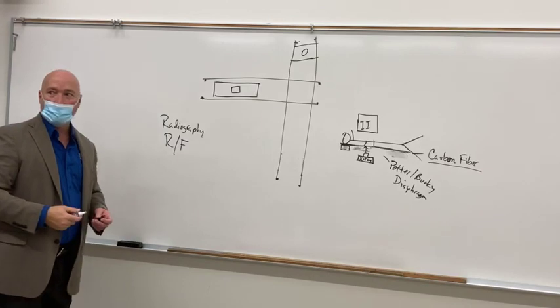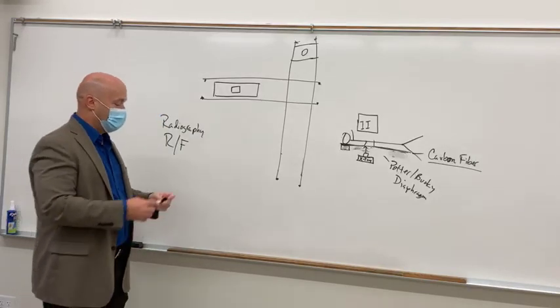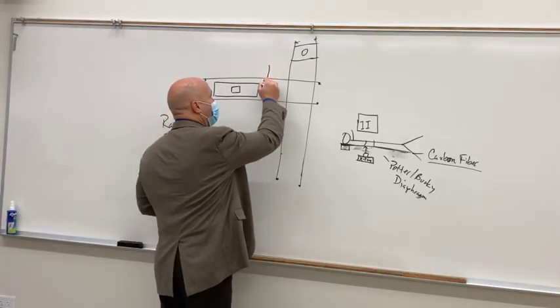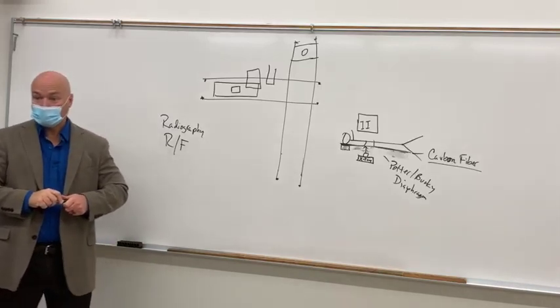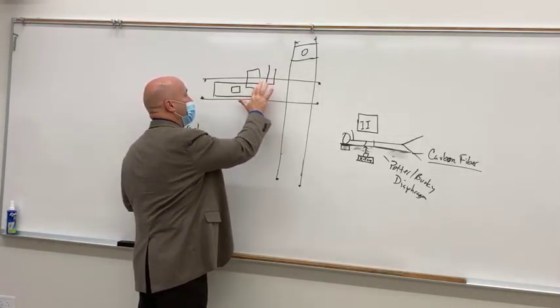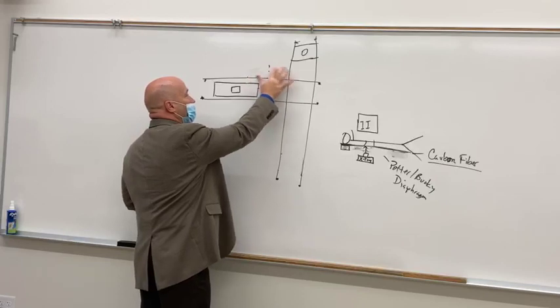Put it somewhere out of the way, usually on the opposite side of the table at one end of the room, as far away from the table as possible, because if you've got that x-ray tube hanging down right here, well, let's say right here, you get that fluoro tower going, something's going to break. I guarantee you something's going to break. The handles are going to break off, something's going to snap. So make sure you get that out of the way somewhere, okay?